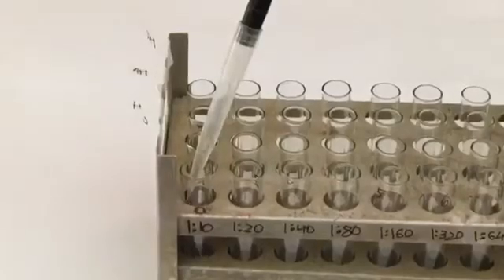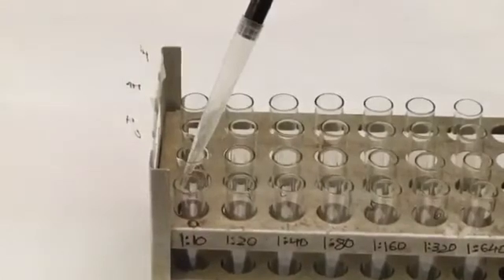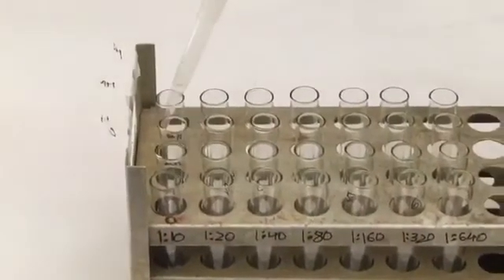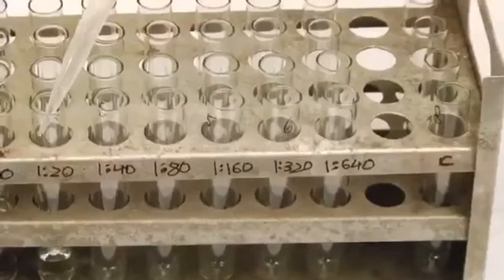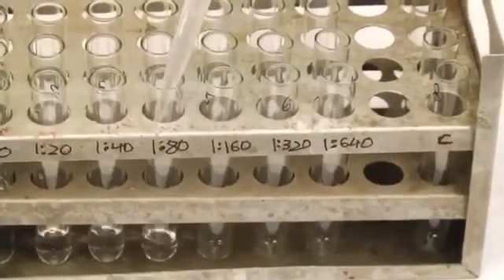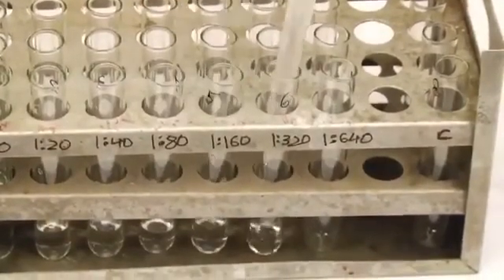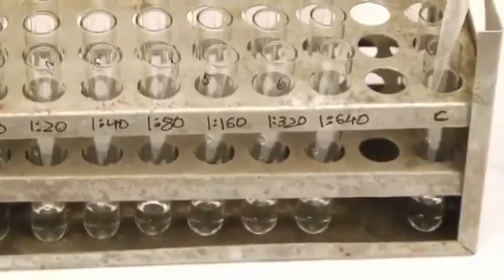Pipette 1.9 ml of physiological saline into tube number 1 of all sets. To each of the remaining tubes, that is 2 to 8, add 1 ml of physiological saline.